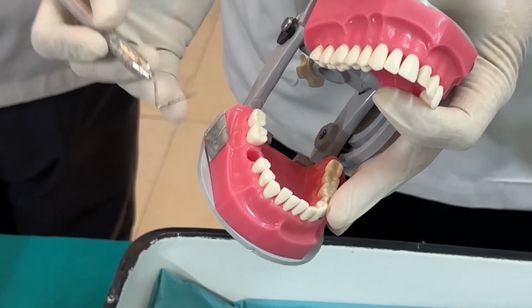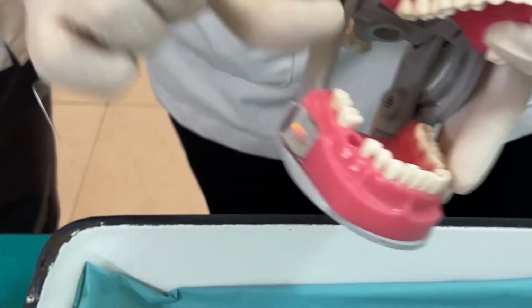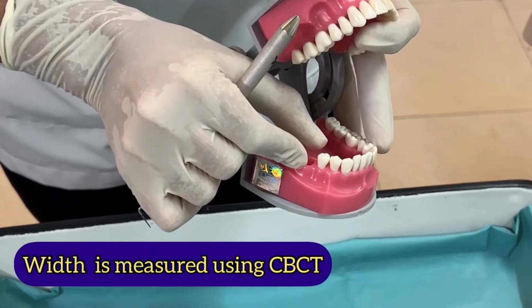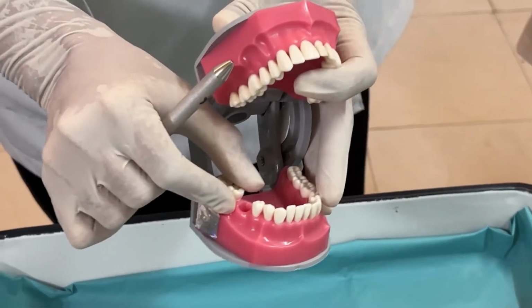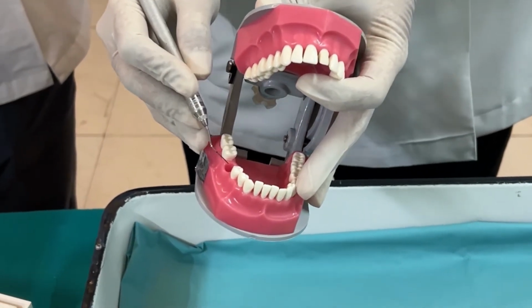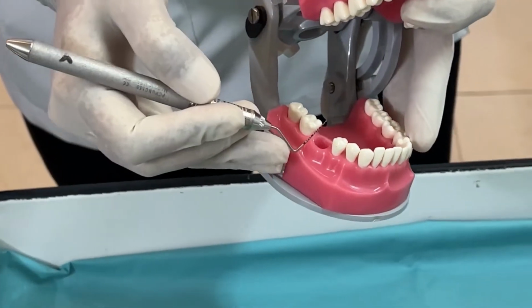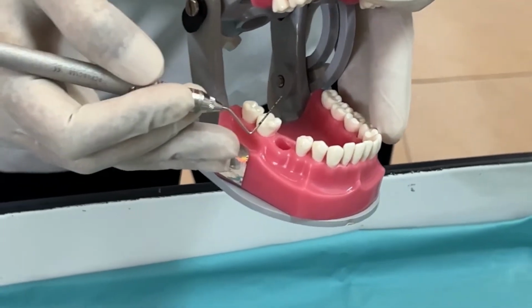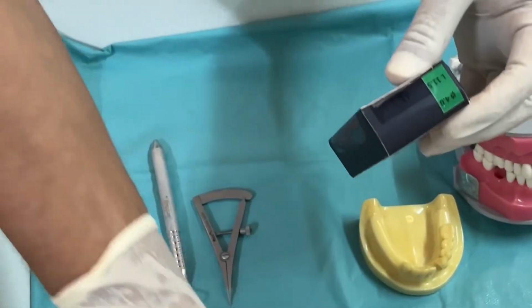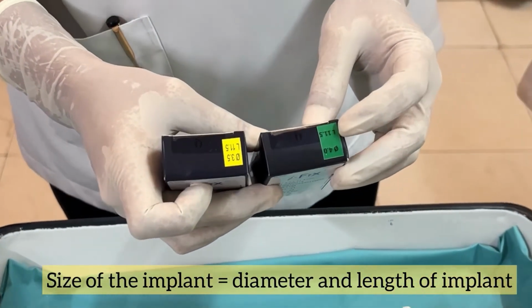But that has given you only a 2-dimensional image. You have gotten to know only the rough estimate of the length. The width is still remaining. So width, how will you get to know? Through CBCT. CBCT will tell you the buccolingual dimension of bone available with which you can place the implant. Now based on these parameters and based on the tooth which you are replacing, you will be choosing the size of the implant that you will be placing. So size basically means the diameter and the length of the implant.